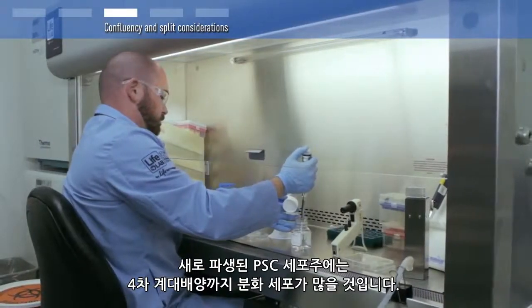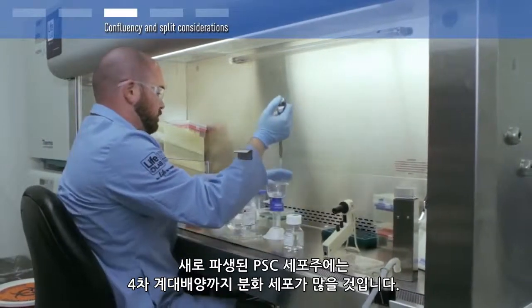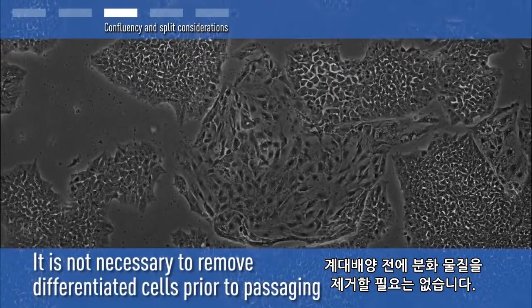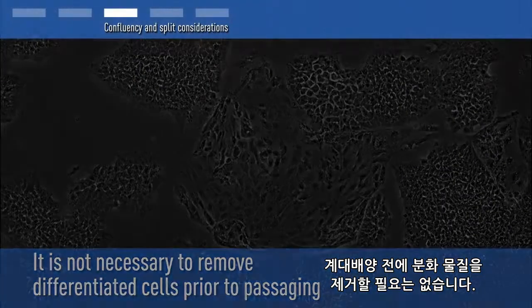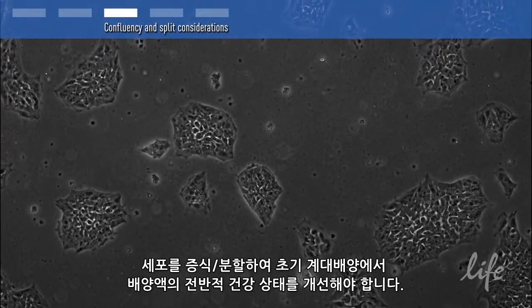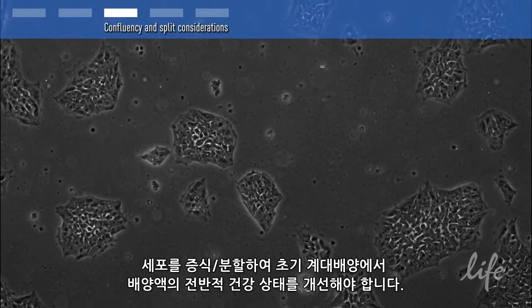Newly derived PSC lines may contain a fair amount of differentiation through passage 4. It is not necessary to remove the differentiated material prior to passaging. By propagating or splitting the cells, the overall health of the culture should improve throughout the early passages.